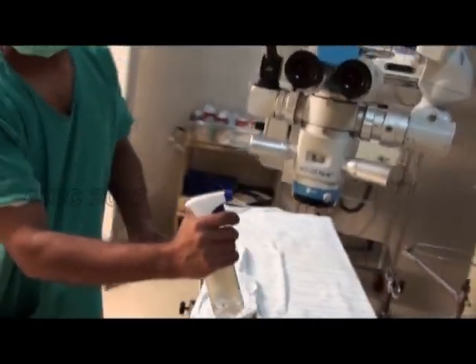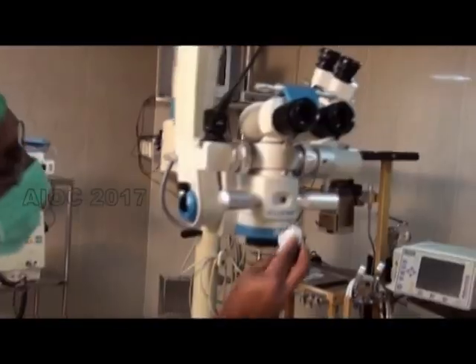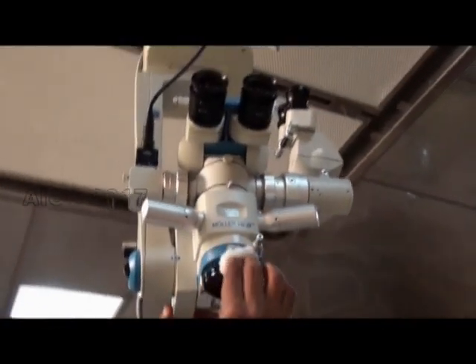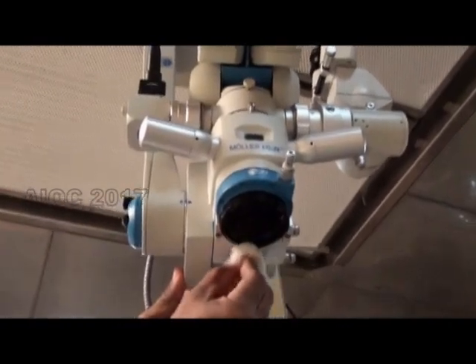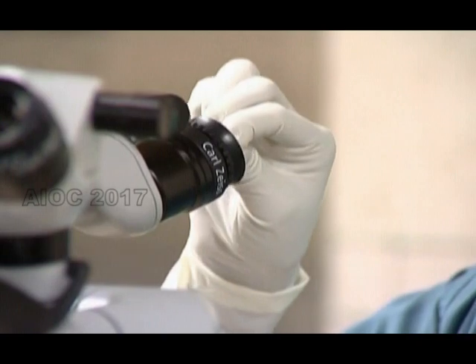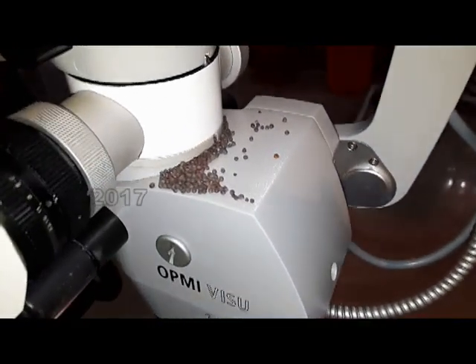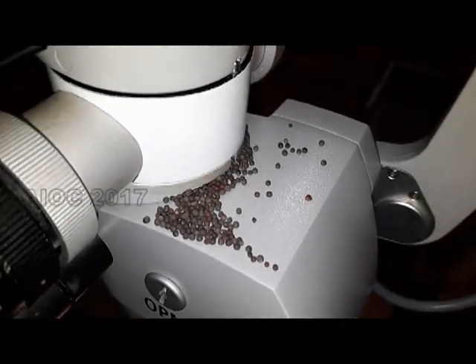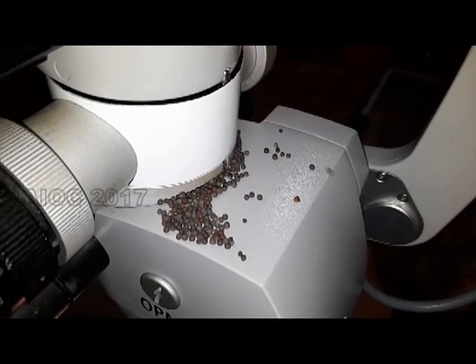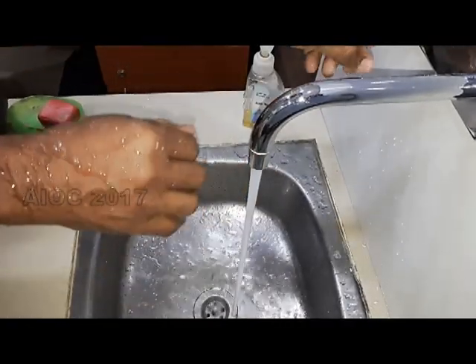Cleaning of the microscope is important before we start the theater. The disinfectant should not be sprayed directly onto the microscope — it has to be cleaned with 70% alcohol. The lens has to be cleaned with lens cleaning solution or distilled water. Suspended particles in the air can settle onto the microscope and drop to the surgical site when the microscope is operated; this is demonstrated using mustard seed.